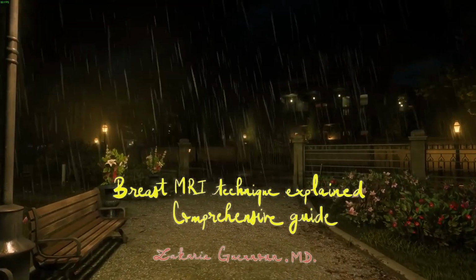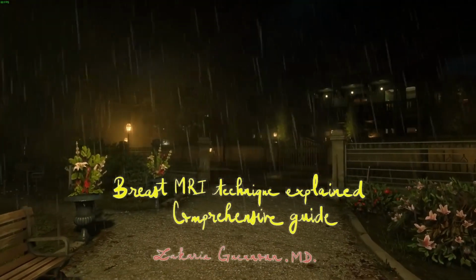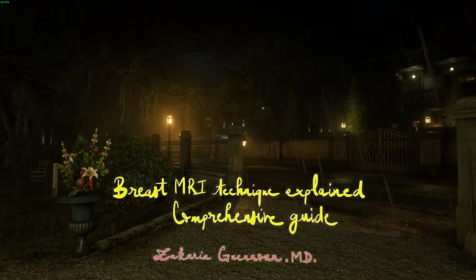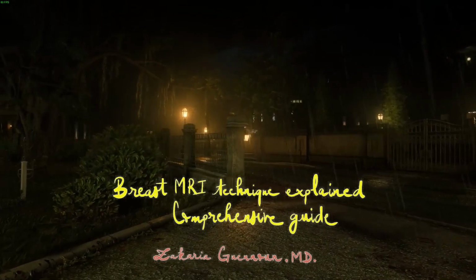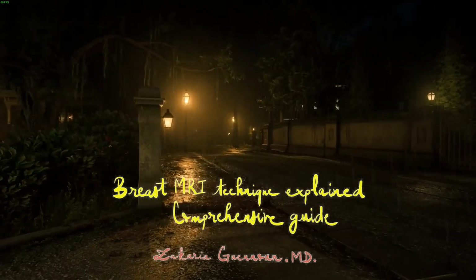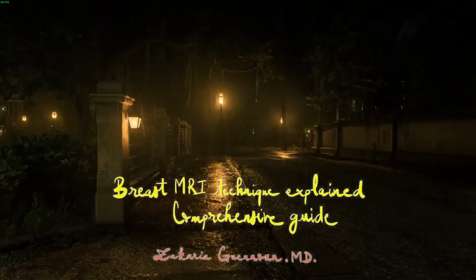First of all, when to schedule breast MRI. It was believed that breast MRI should be done during the second week of the cycle, but no paper has demonstrated any benefit of doing that. Technically, you can do it at any time. We need a 1.5 or 3 Tesla MRI machine, and the sequences used are straightforward.